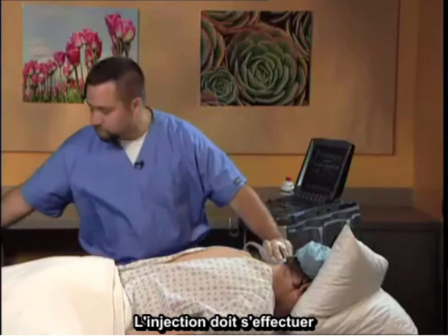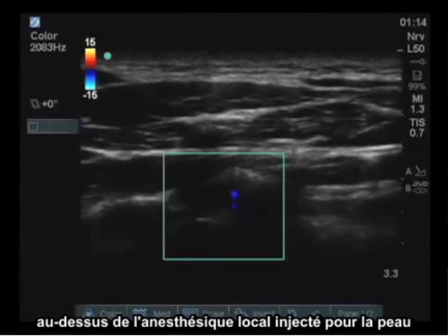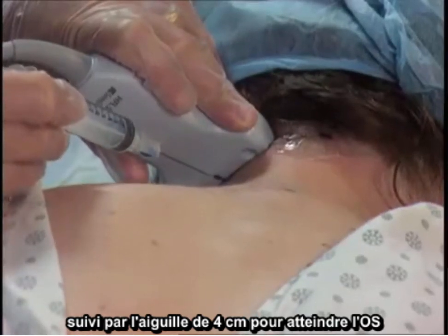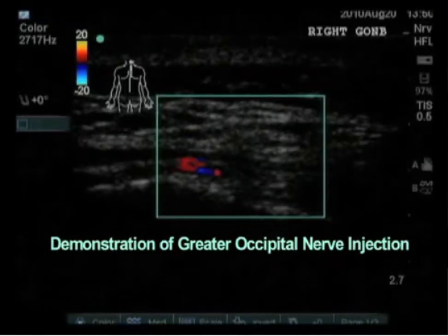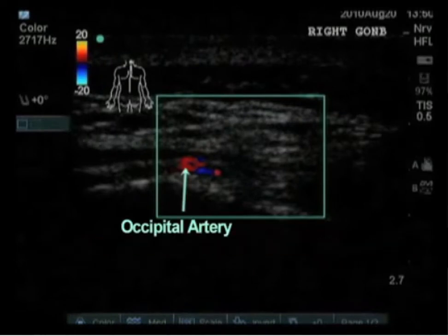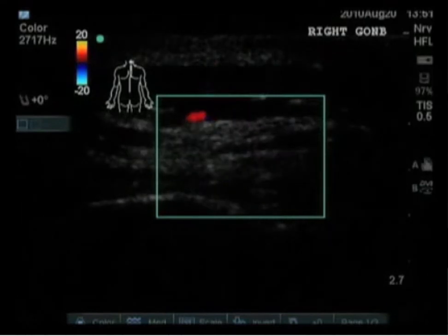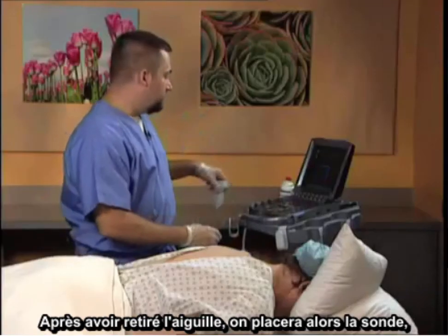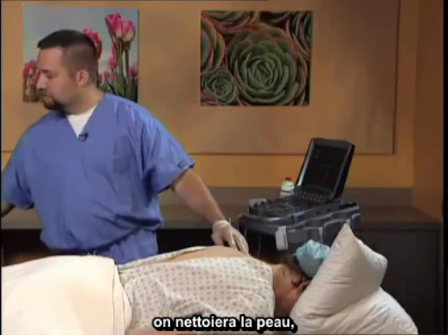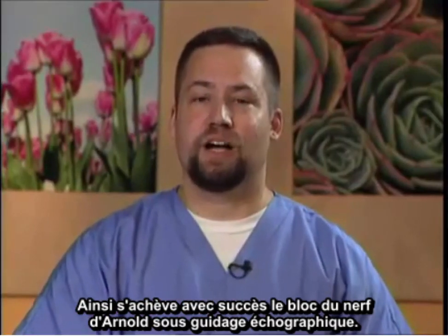The injection would occur above — local anesthetic injected for the skin — followed by the one and a half inch needle to contact and avoid entry into the blood vessel. The needle is then removed and the probe placed. The area is cleansed and a band-aid placed over the incision. This concludes the successful placement of a greater occipital block under ultrasound guidance.